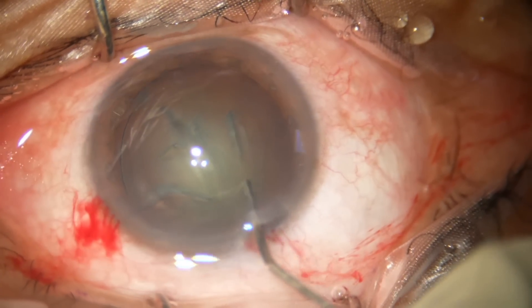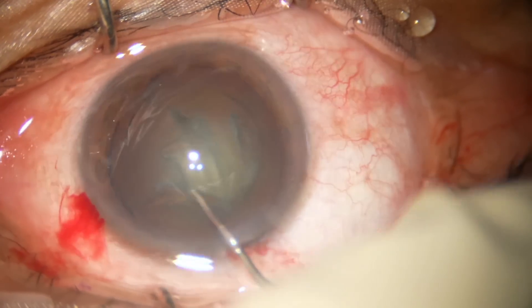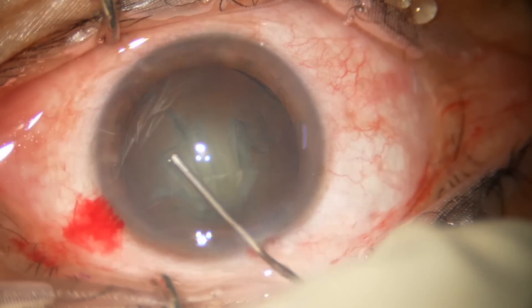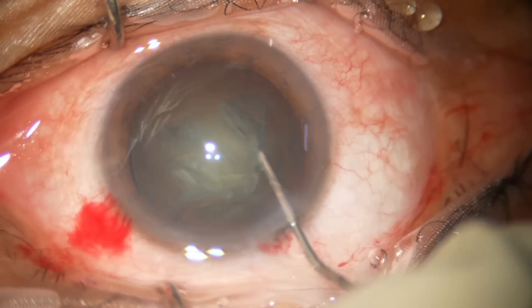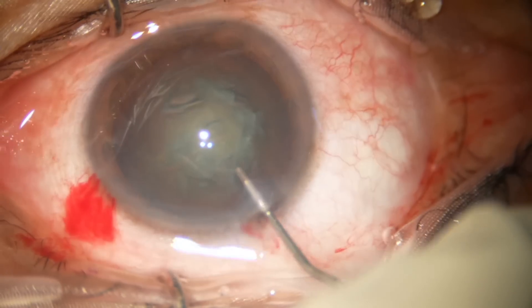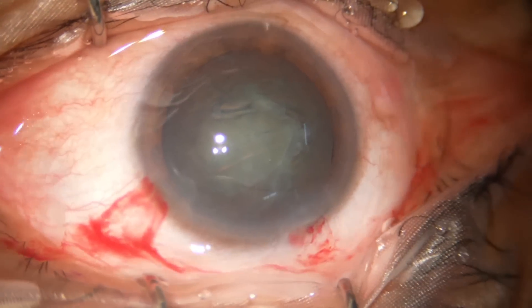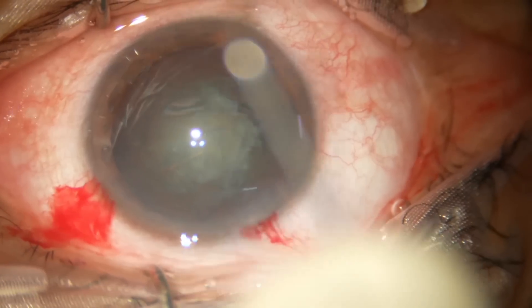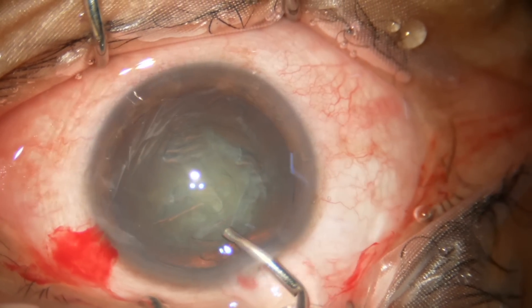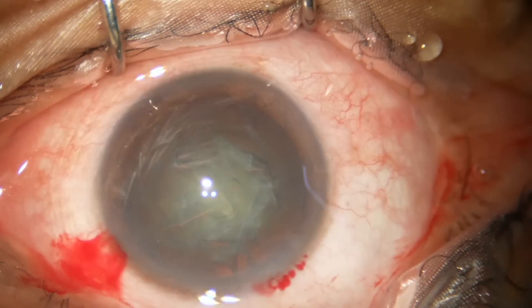Press on the nucleus and rotate the nucleus. If it doesn't rotate, that means the capsulocortical adhesion is still there, so you can do some more hydrodissection and then try to rotate. Now we are going to make a trench to divide the nucleus into two halves.